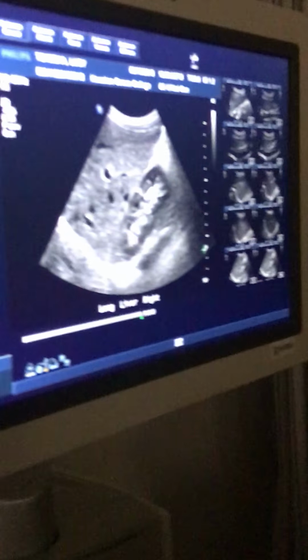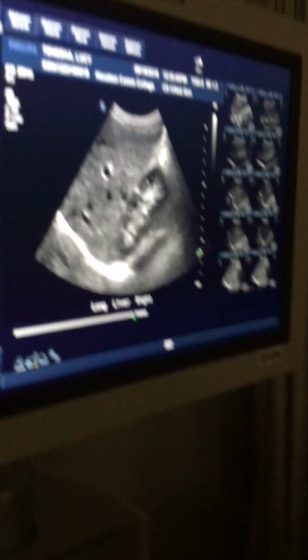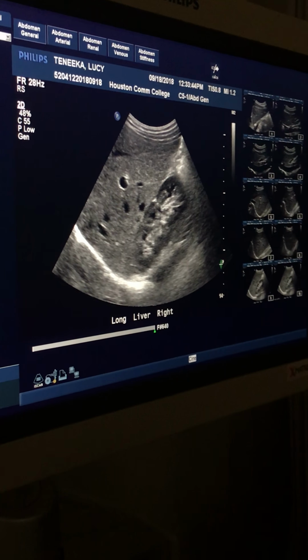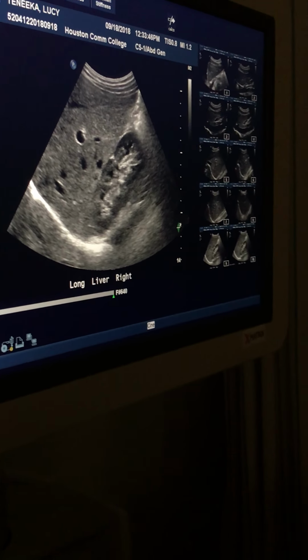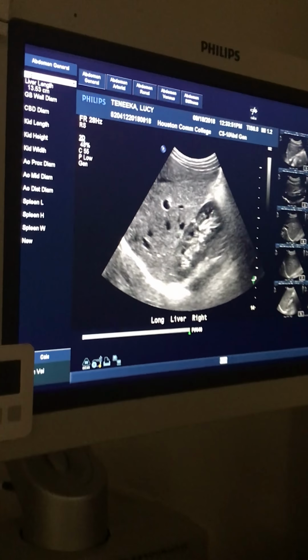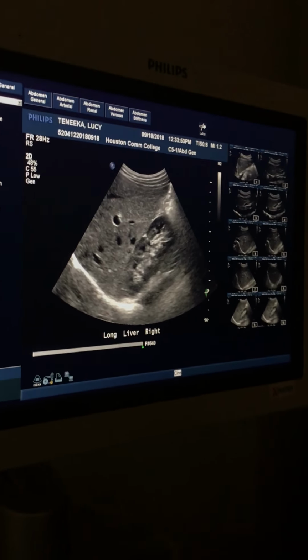So let's say I angle medial. That looks good, but it's off center. So if I heel down and then angle back, that looks nice. If I push it even more and then twist this way, that looks even better. So it's a whole lot of toe, heel, lateral, medial, twist, right? You're just basically trying to center those two organs together and then open it up nicely. Okay, so that is all your long pictures.